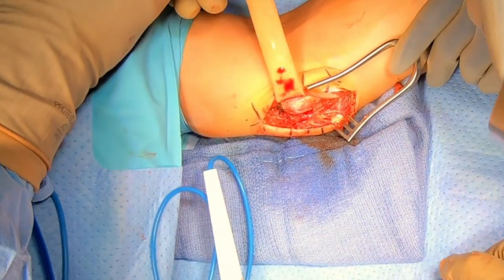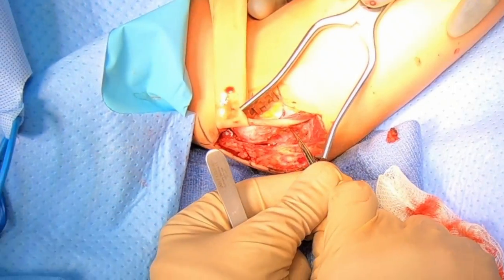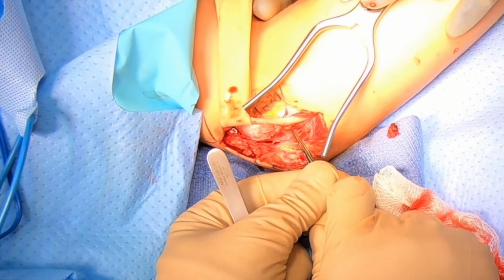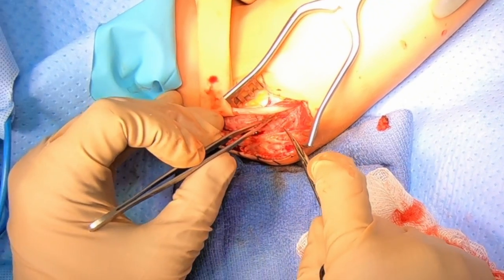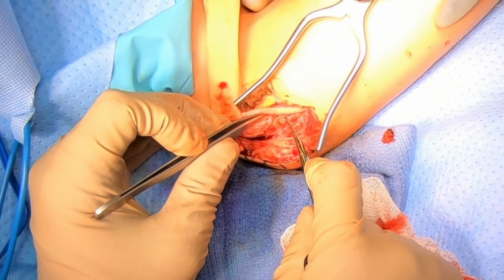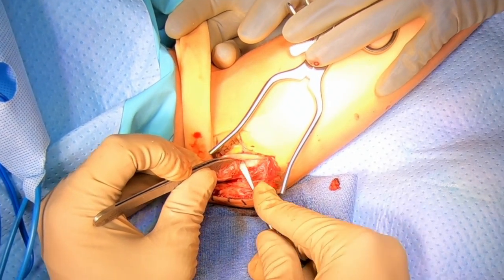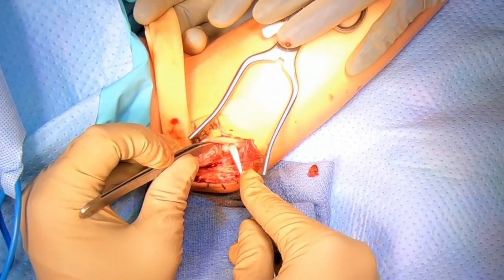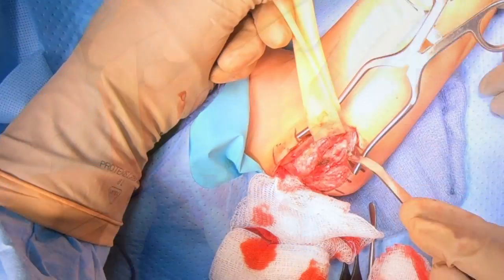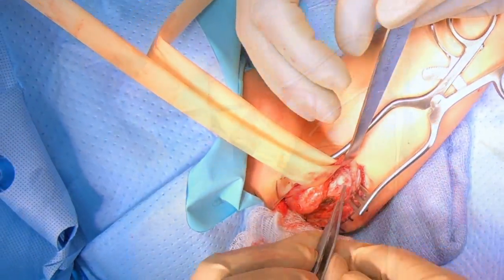I'll move the nerve here out of the way. The nerve is now moved and we can begin to work to elevate some of the muscle on top of the ligament. This is called the flexor pronator. It's really important for function of the elbow and hand, so we'll be careful to make sure we don't damage any of that muscle. You see me here carefully elevating the muscle to get a clean exposure of the ligament without damaging the muscle on top. Now we have a complete exposure of the ligament.